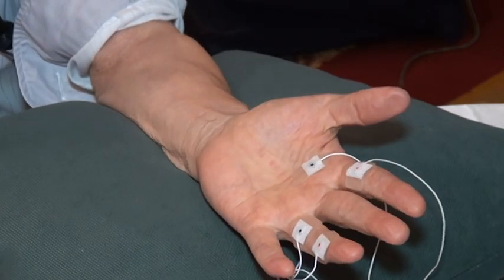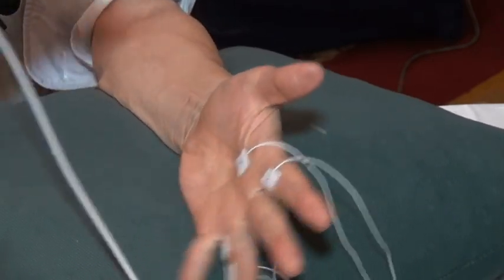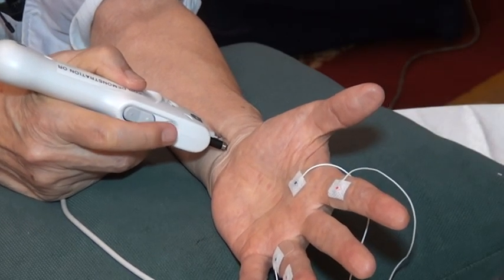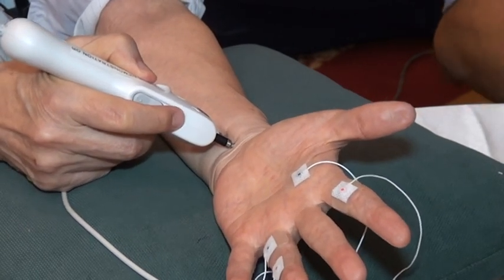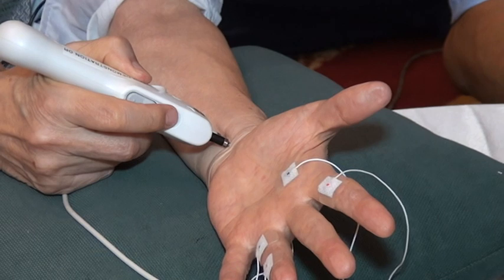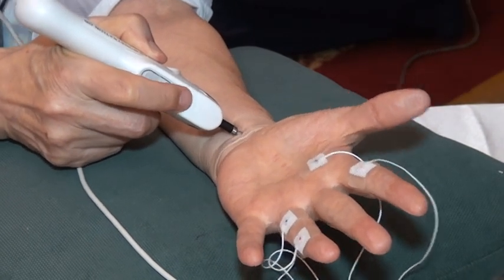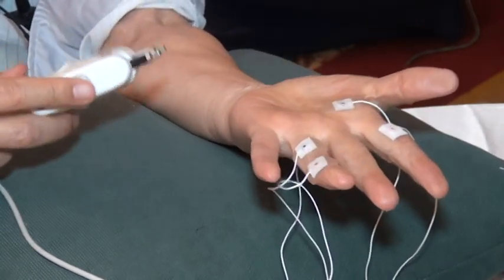Let me show you. Motor, right? Let me show you the median nerve first. And I'm going to stimulate. Okay, give me a higher gain. 1 millivolt already. Oh, I should have a better response. I think my nerve is getting tired. But that's okay. Okay, take that. All right, now I'm going to stimulate the ulnar nerve.